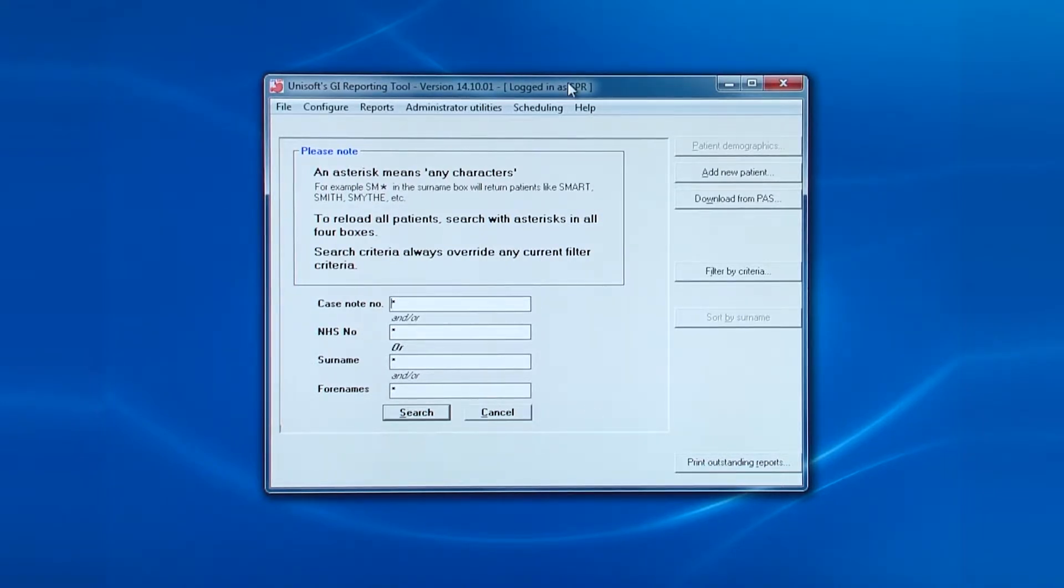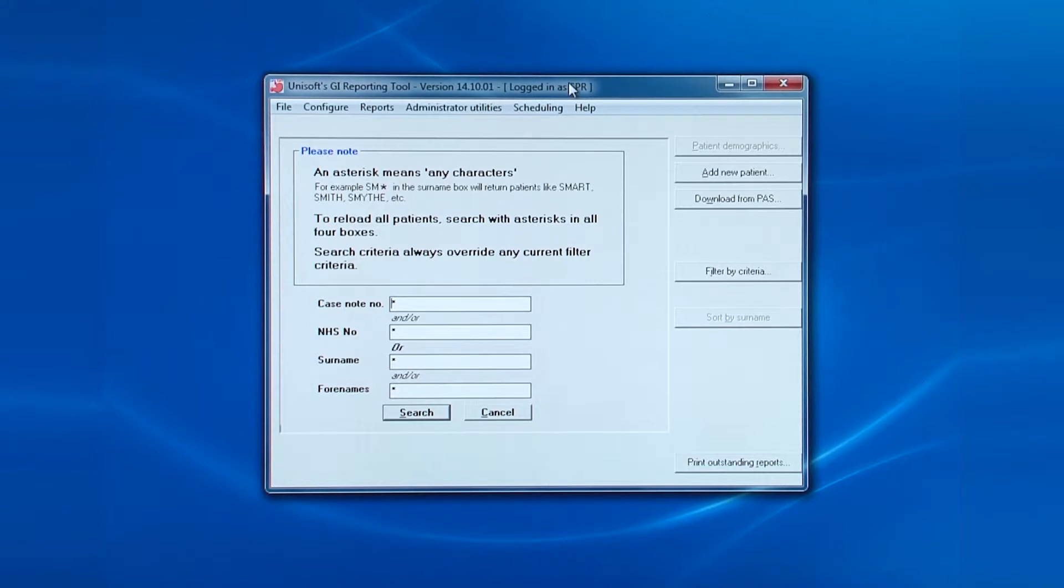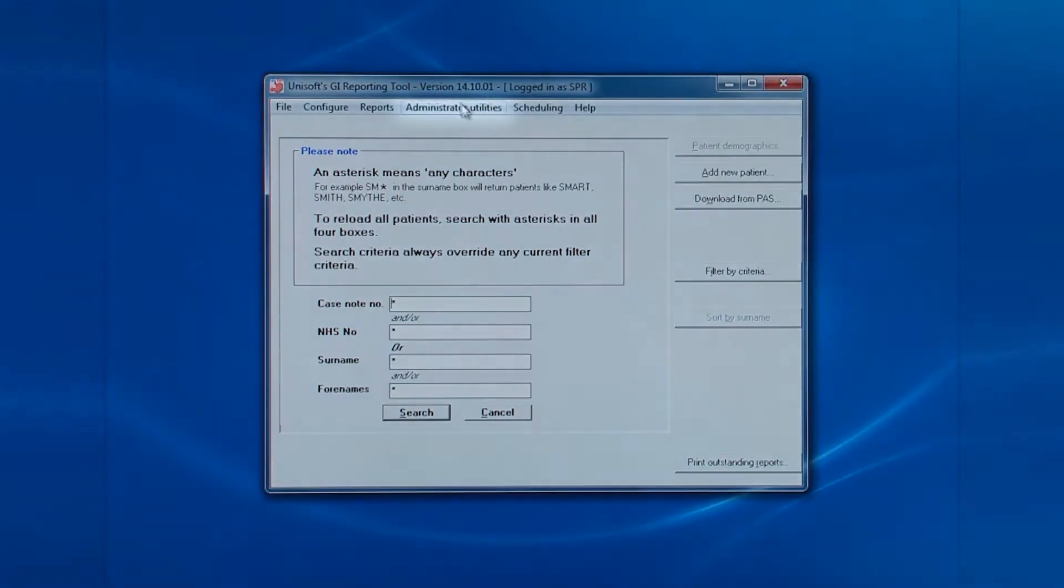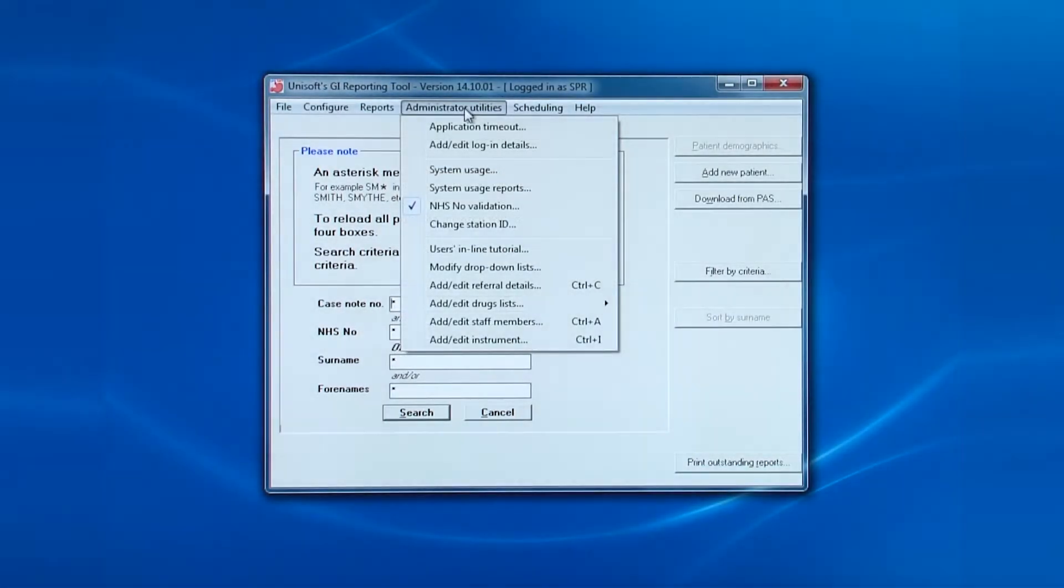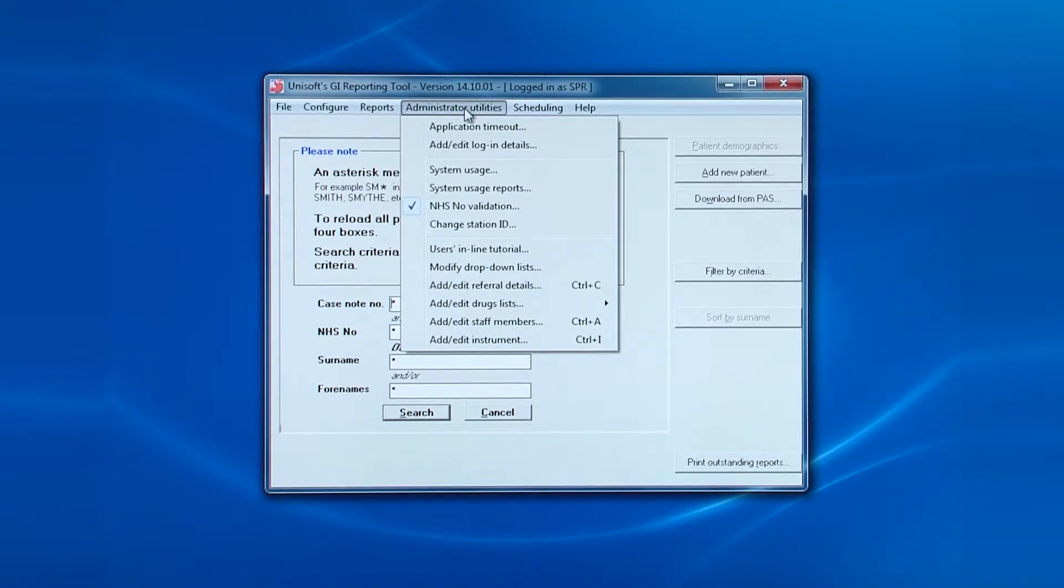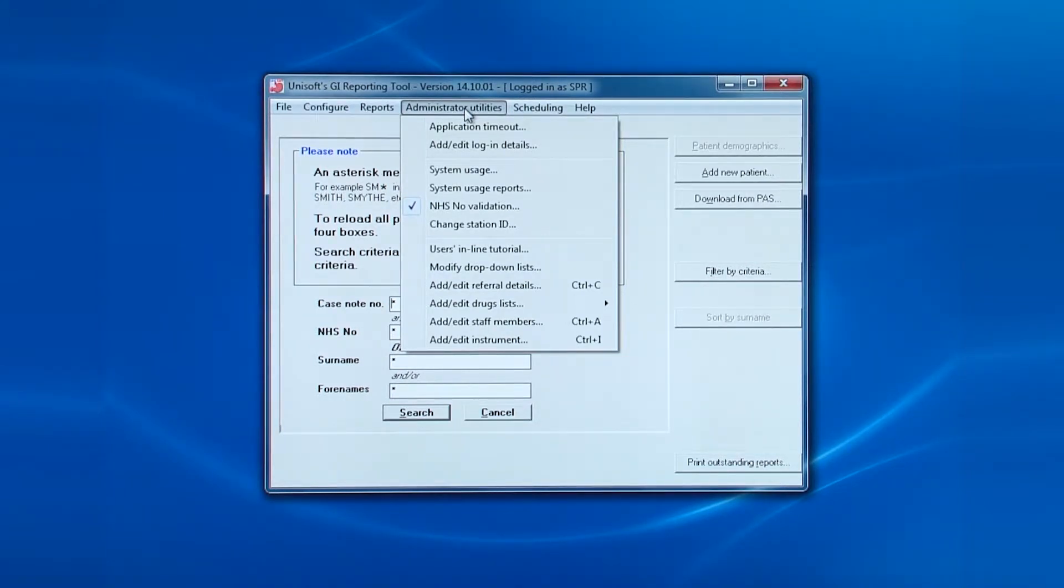That covers the configuration menu. So now let's look at the administrator utilities. This menu is enabled if admin or an administrator is logged in. It will be grayed out if a regular or read-only user is logged in.